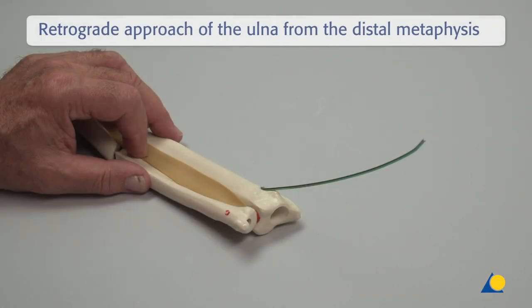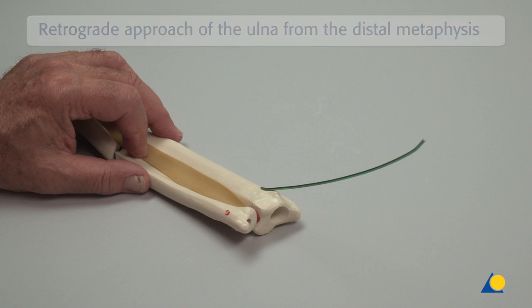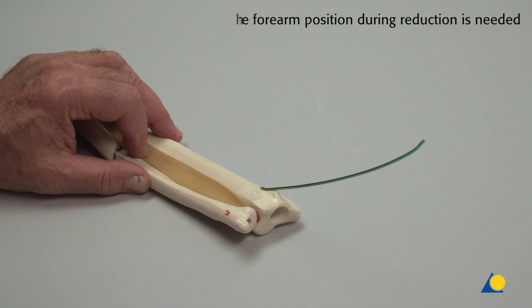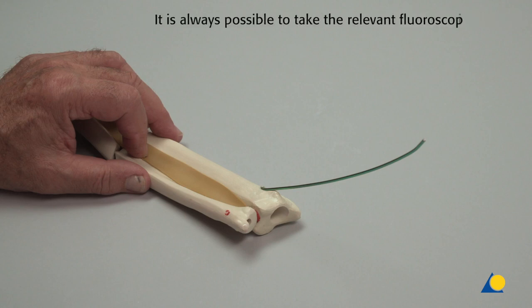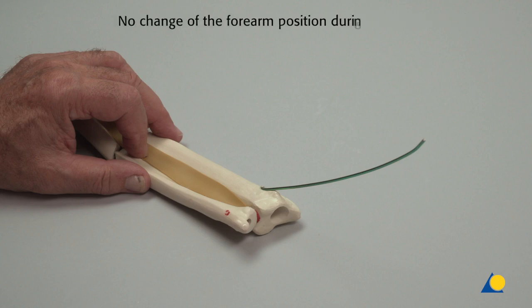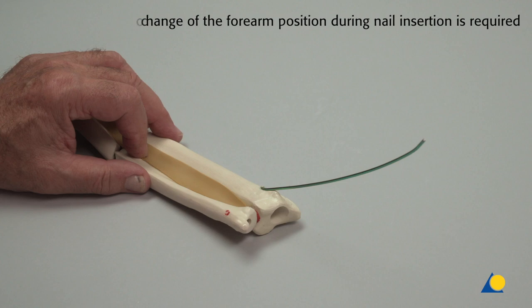The advantages of the retrograde technique are as follows: no change of forearm position during reduction is needed; it is always possible to take the relevant fluoroscopic views; and no change of forearm position during nail insertion is required.